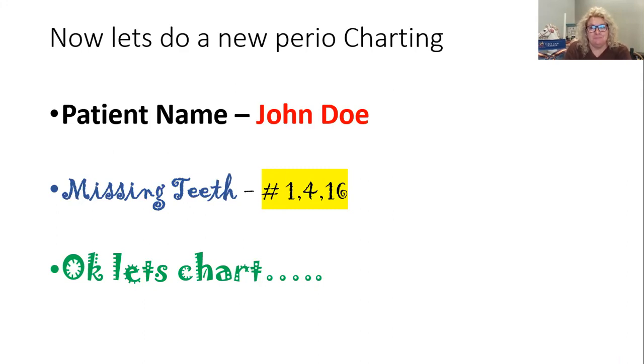So we're at the distal. So where am I? And everybody should have said distal buccal number 7. And I'm going to continue with the numbers. I'm not going to go slow. We're going to keep on going. 3, 2, 3, 2, 2, 2, 2, 1, 2, 2, 2, 2.